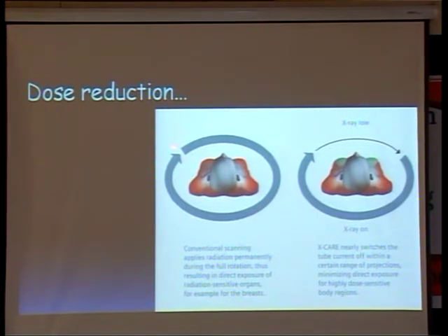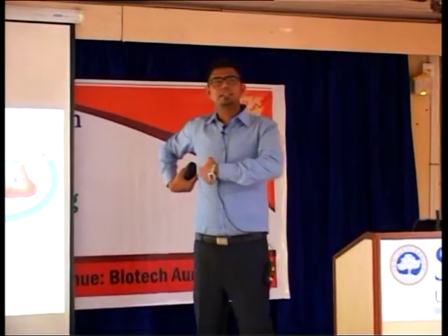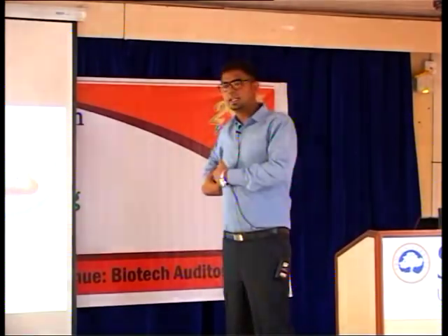So, as we had covered in the previous slides, this is a gantry. The X-ray source is moving like this, and the detector as well. So see the anatomy. For example, if you scan a patient's chest, and the source is from this side, the detector is behind you. So the depth is less, so you require a lesser dose.